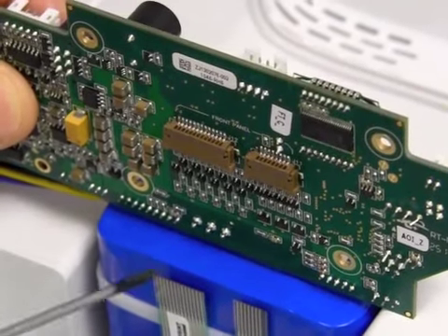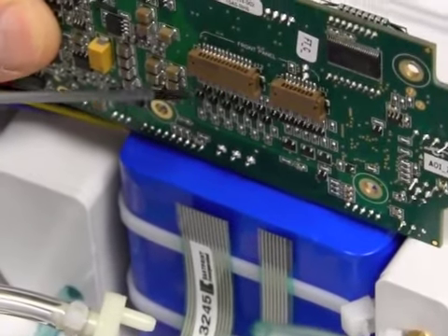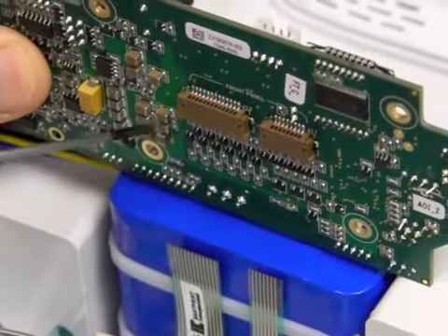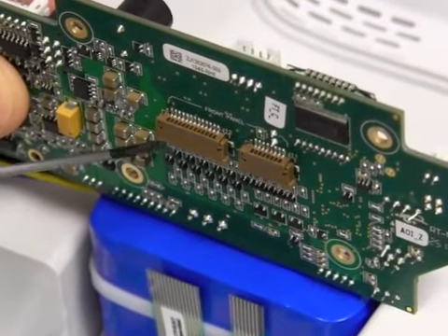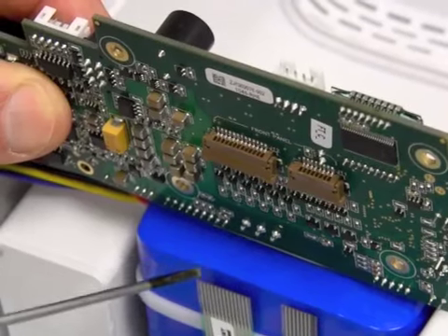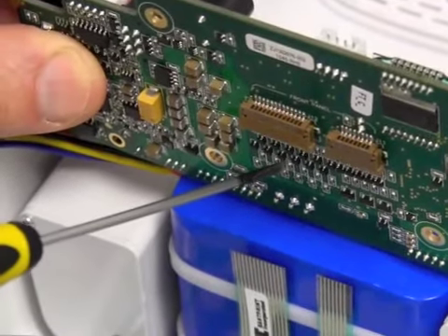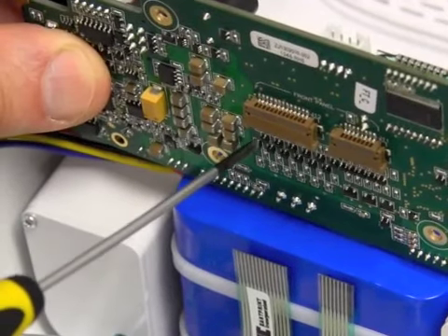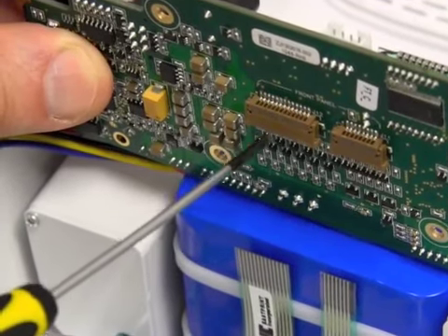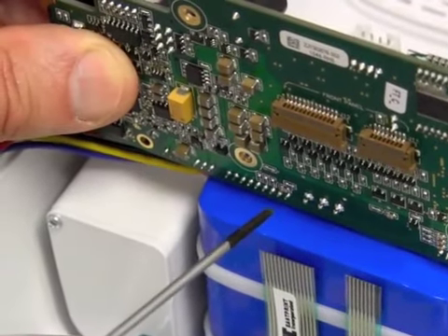Okay, the next step is to reinsert the ribbon cables into the corresponding clips, and you can tell that these clips are now free and they're ready for the ribbon cable to be reinstalled. So what you have to do is push the ribbon cable into the clip and then push against the clip onto the board so that the clip retains the ribbon cable.